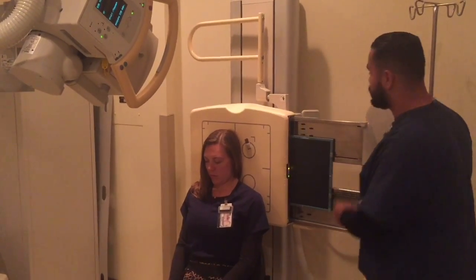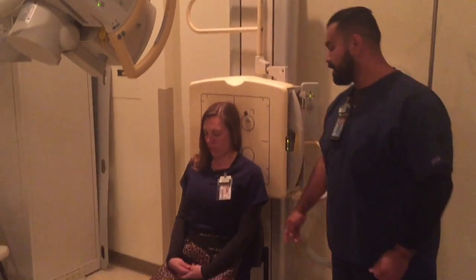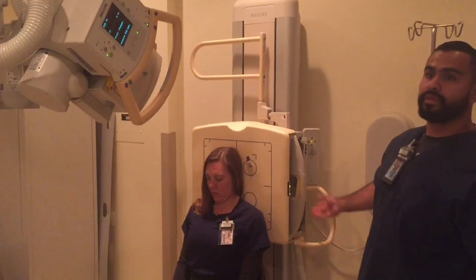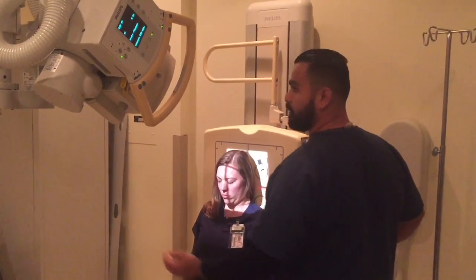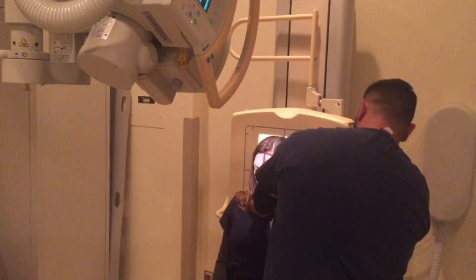I have a 10 by 12 IR in a lengthwise orientation. Patient has lead currently. I have a left marker on the left side to indicate where she's at. So now that I'm making sure that the patient is properly positioned, I will position her.